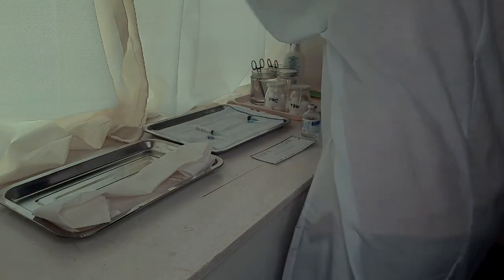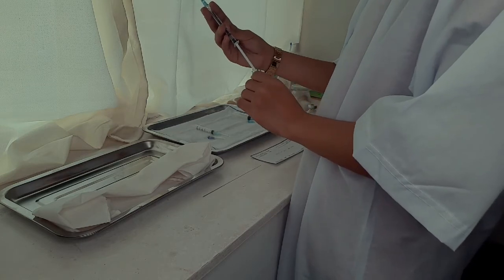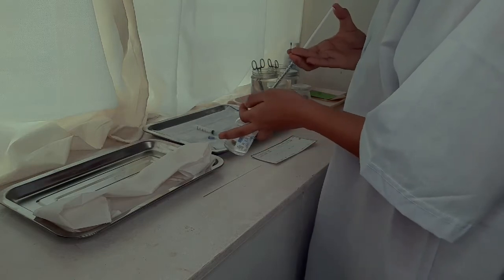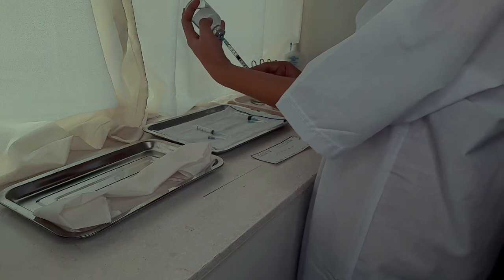Air has to be injected into the vial prior to aspirating 1 ml of sterile water. The amount of solution aspirated has not reached 1 ml, thus we need to aspirate more until such time we obtain 1 ml of solution.